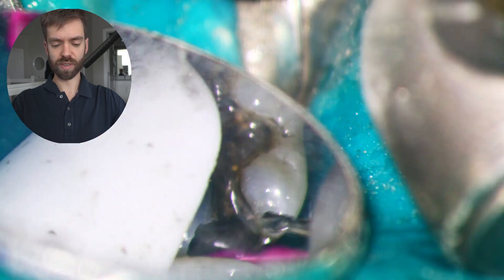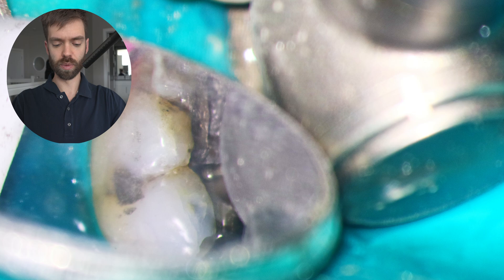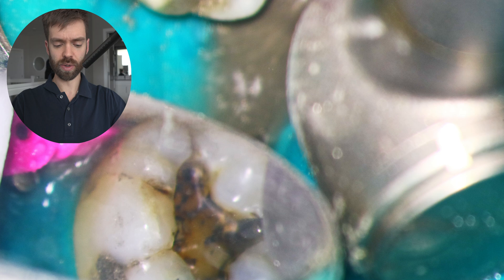You'll also see that little white tube on the left side of the screen. That's creating a little bit more negative pressure so that we suck up all those vapors as they're coming out.